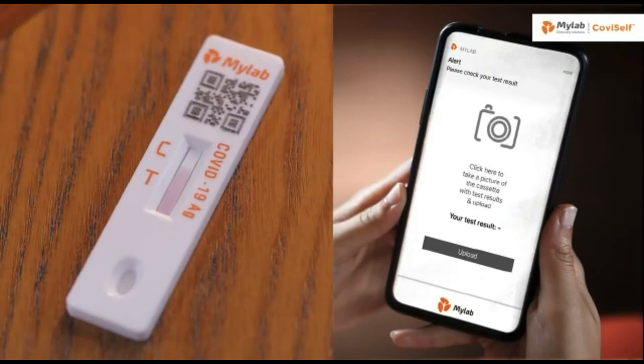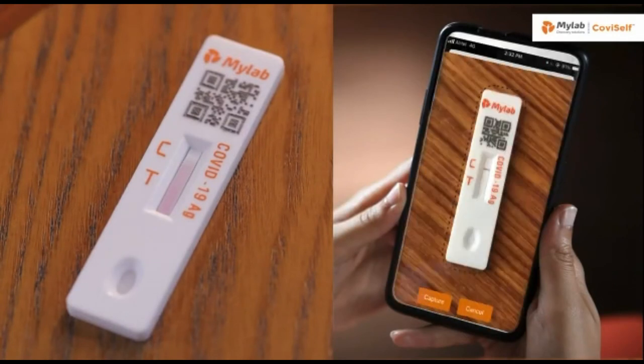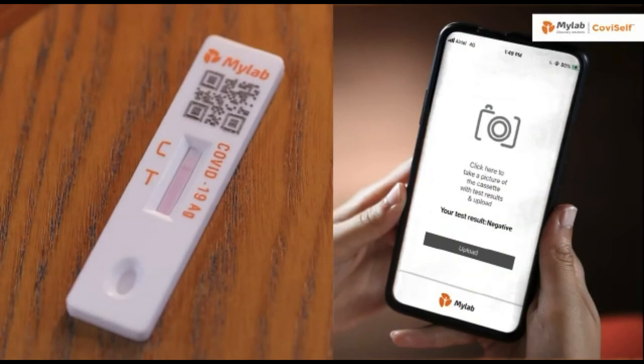At 15 minutes the MyLab CoviSelf app will raise an alarm. The software has an intelligently designed AI which gives accurate results. You can now download your COVID-19 report from the link.